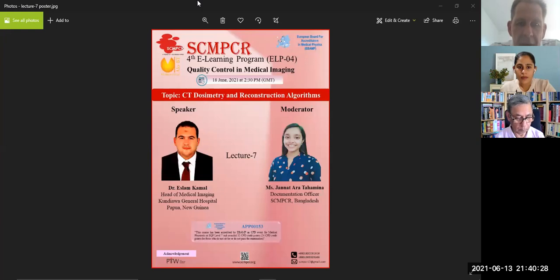Is there any relation between the thickness of the detector and the energy in the photon beam? Yes, there is. Now we come into very much detail. The vendors are hard to give. If you look into the NEMA, you find some interesting things about detectors. The efficiency of the detector depends on the thickness of the detector, and also on the pixel size you're using and the energy which is provided. There is a relation, yes.